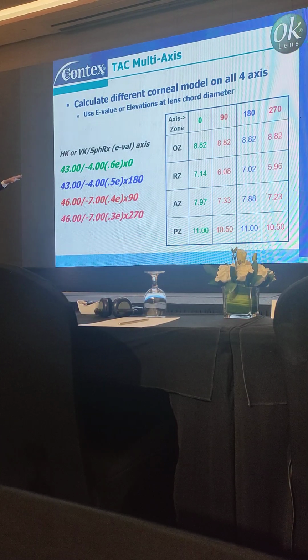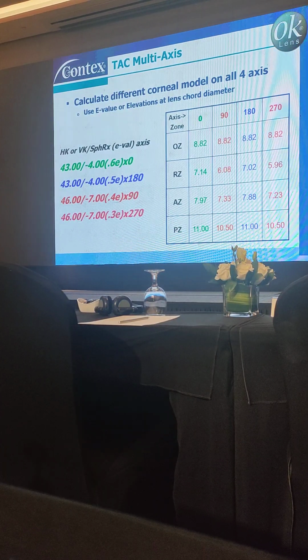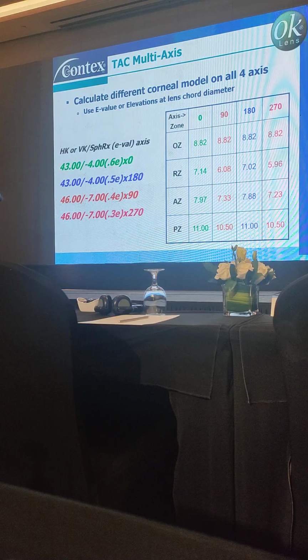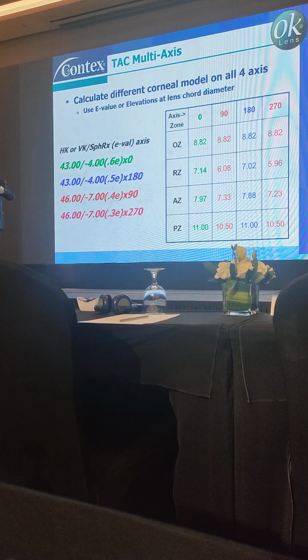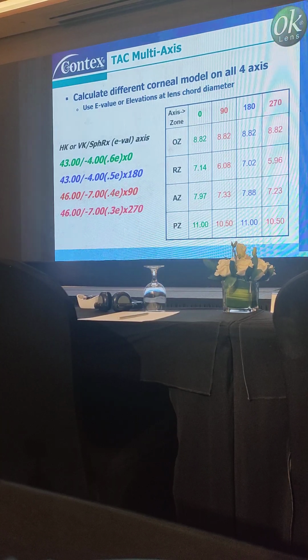And when we're changing radius like that, a lens like this can take us 3 minutes to cut. And a spherical lens, we can cut it in 40 seconds. So that's why we charge more for the toric lenses. Okay?